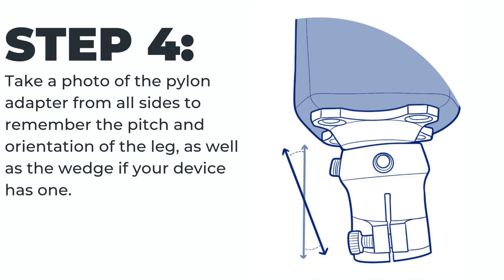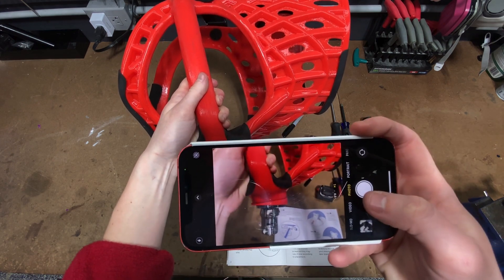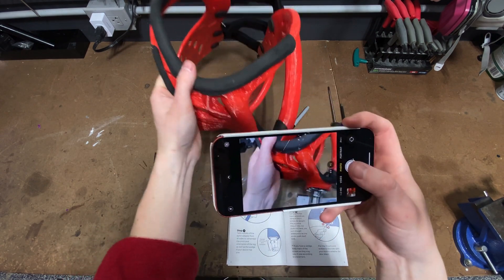Step four: take a photo of the pylon adapter from all sides to remember the pitch and orientation of the leg, as well as the wedge if your device has one. It's important to note the distance of all the adapter screws so that when you put it back on, you maintain the same pitch the leg was previously set at.